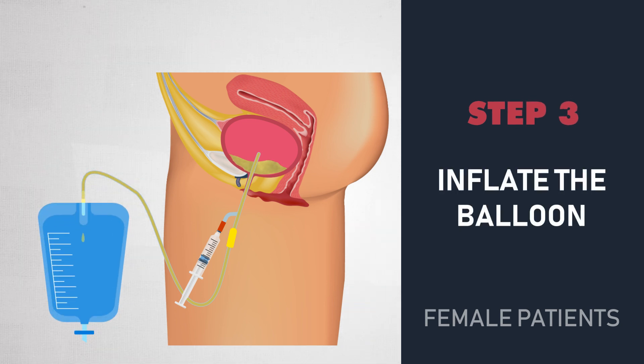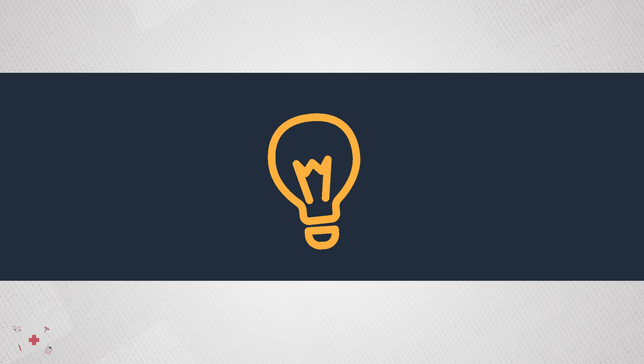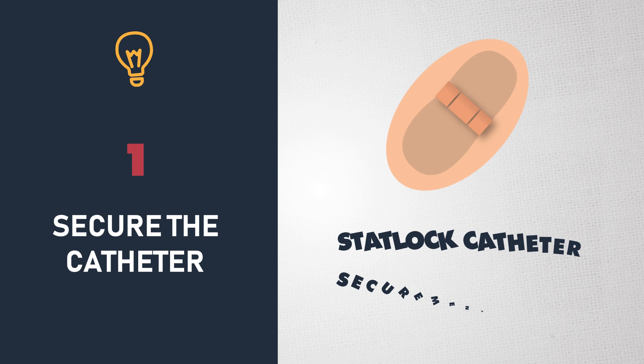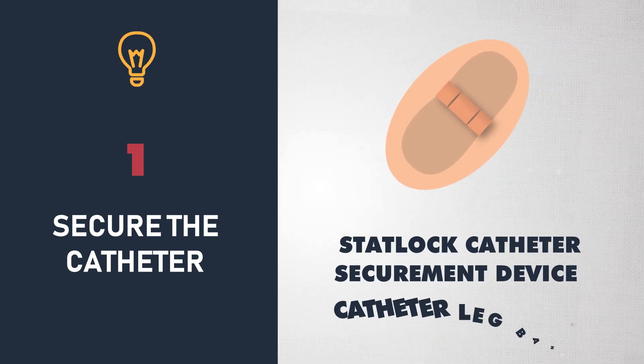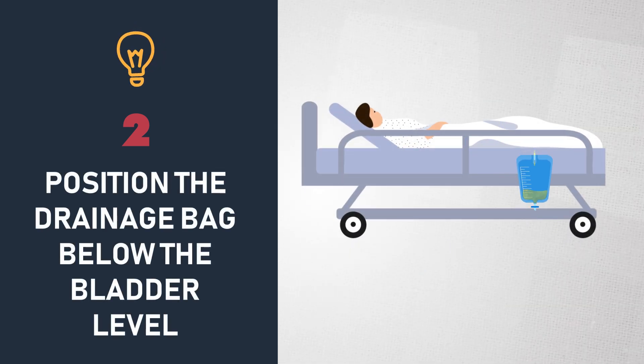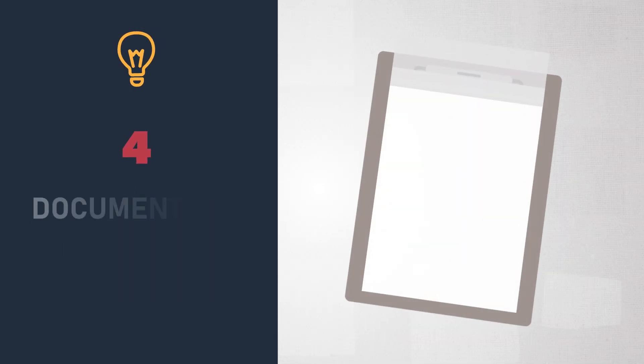Use your non-dominant hand to hold the catheter steady and inflate the balloon. Give the catheter a gentle pull to confirm it is placed. It is important to remember these steps after the procedure: always secure the catheter using a StatLock device or a catheter leg band. Position the drainage bag below the bladder level — attach it to the bottom of the bed and use a privacy bag. Always check for kinks, and always document the procedure.